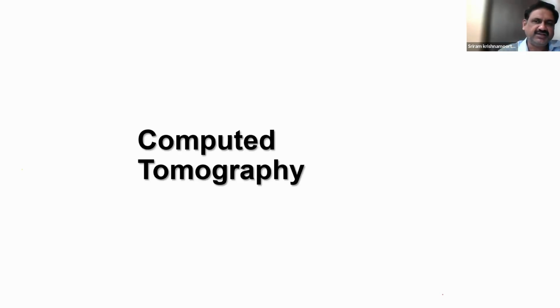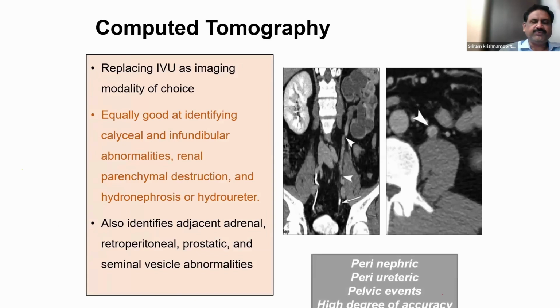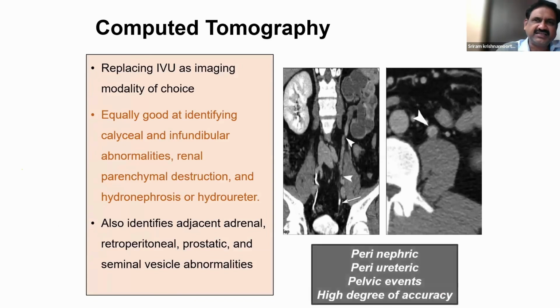We'll move on to the third one. We have finished IVU, we have finished ultrasound. The more important one these days, which we routinely do day in and day out, is CT scan. Role of computed tomography. It's very important for us to see. It's a very common question that is asked in the exam.